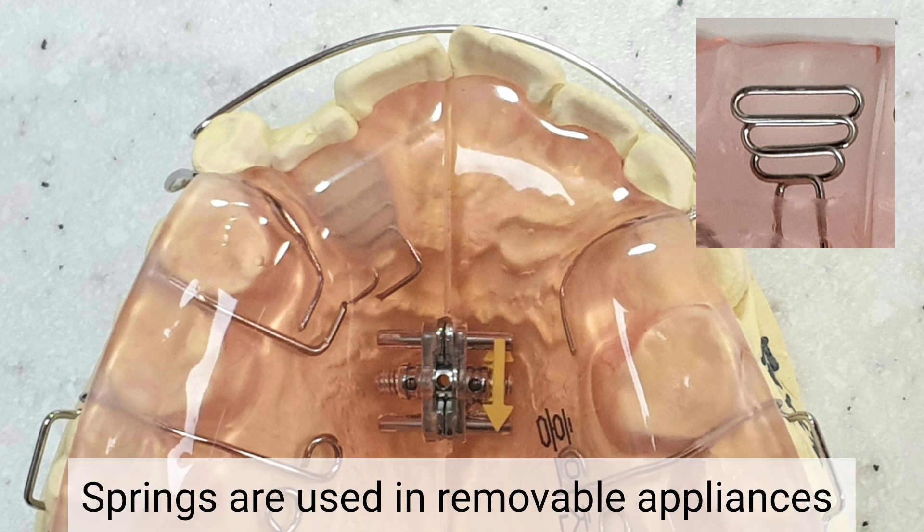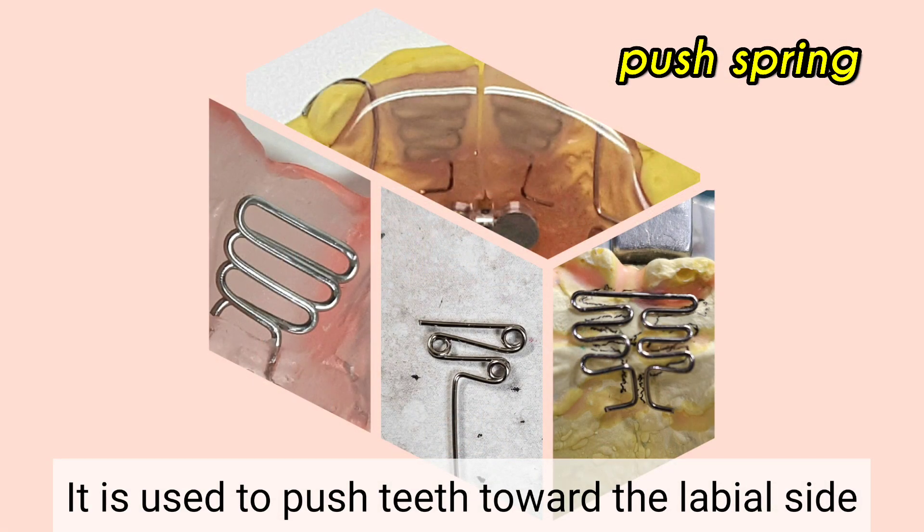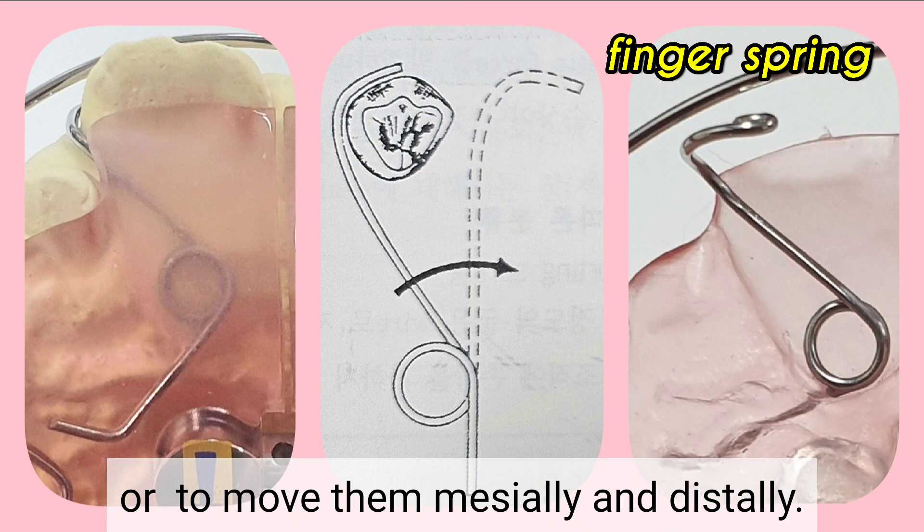Springs are used in removable appliances to move teeth in a desired direction. Functionally, they are divided into two types: they are used to push teeth toward the labial side, or to move them mesially and distally.